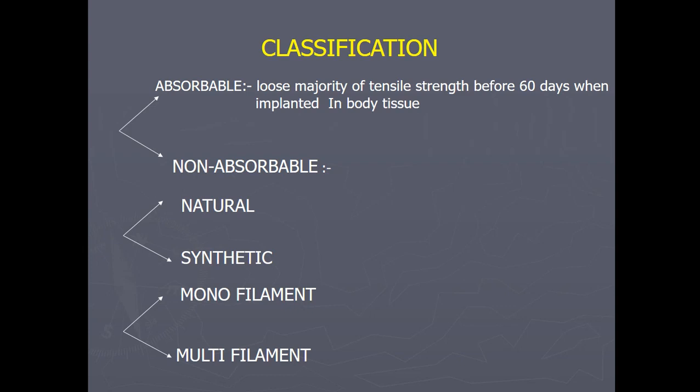Classification of sutures: absorbable, non-absorbable, natural, synthetic, monofilament and multifilament.